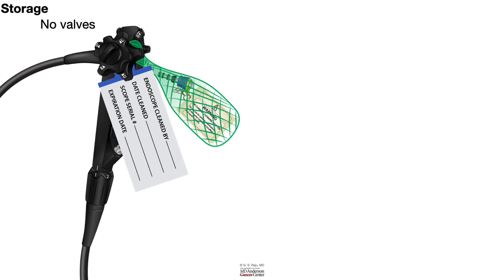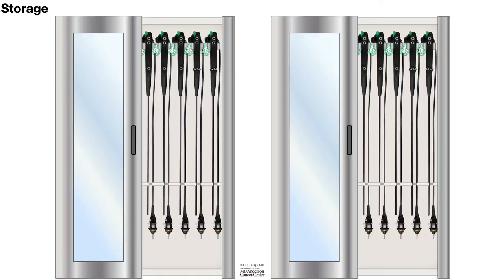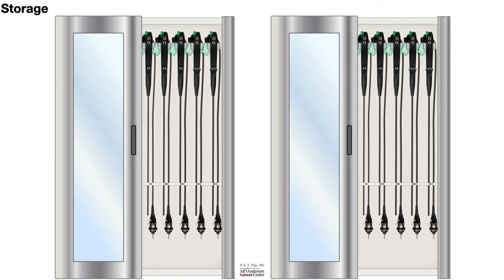But make sure that you do not attach any of the valves to the scope when you take it to the storage chamber and hang the scope vertically down. That vertical down hanging of the scope will get rid of any moisture that has not yet been cleared. It's very important to do this, hanging the scope vertically straight down.